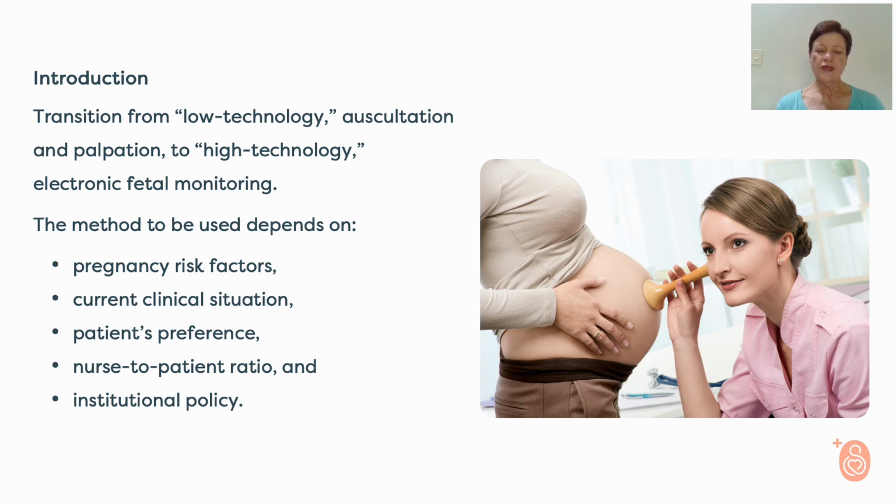We will come to that again and discuss it again. The nurse or midwife to patient ratio also plays an enormous role. To a certain extent, the CTG helps us to observe the fetal heart rate when it's really very busy. It also depends to a very large extent on the institutional policy on when CTGs are supposed to be done and when not.